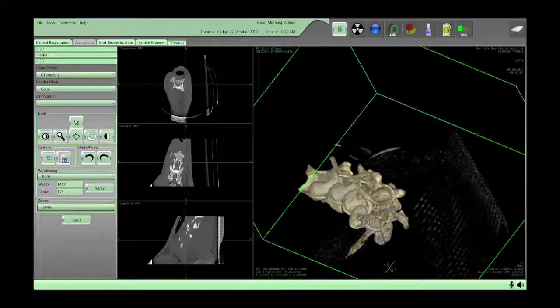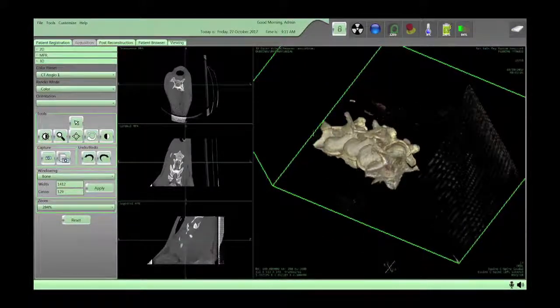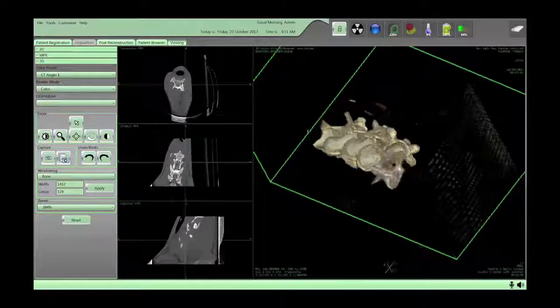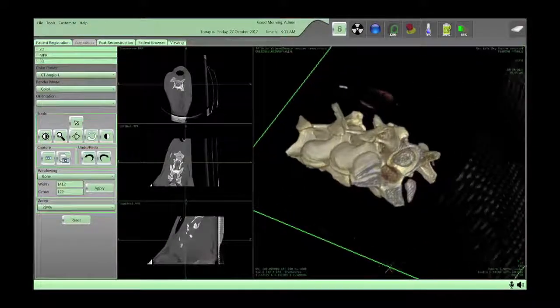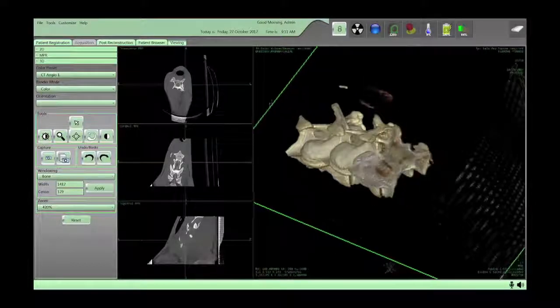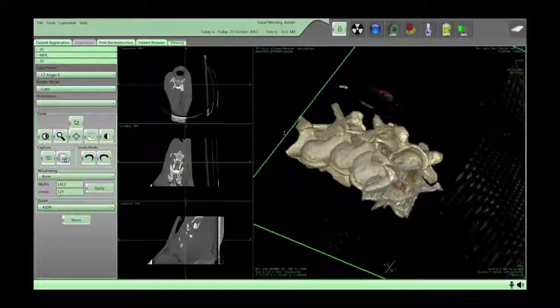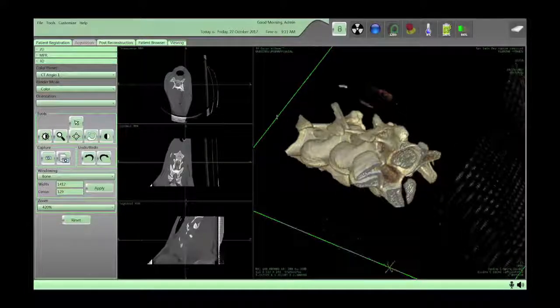unilateral component. The majority of the cervical spine pathology has already been shown to be in the caudal cervical spine. So being able to uniquely see in 3D back at that level has been a huge push for the clinic, as well as for an advancement for spinal imaging in horses.